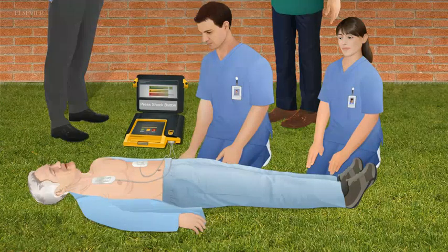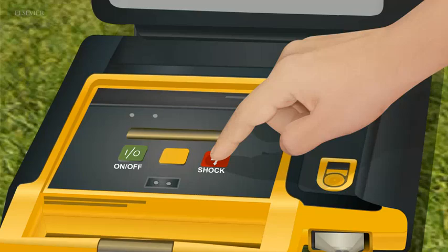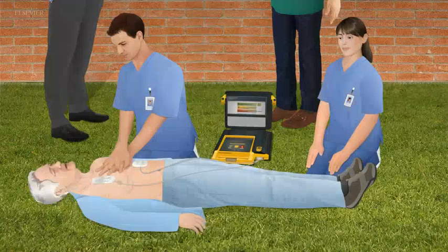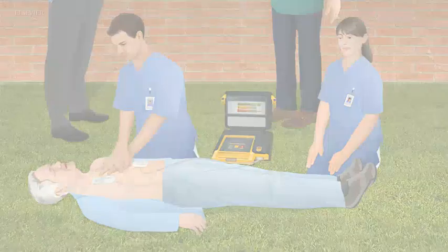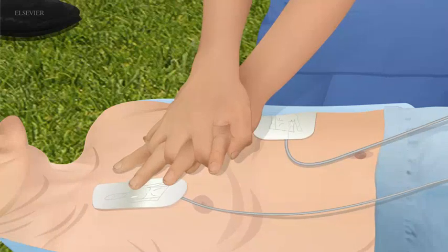Announce loudly to stand clear of the patient and perform a visual check to ensure that no one is in contact with the patient before pressing the shock button. Continue 2-minute cycles of CPR and listen for AED prompts until the patient regains a pulse, the ACLS team arrives, or the practitioner determines death.